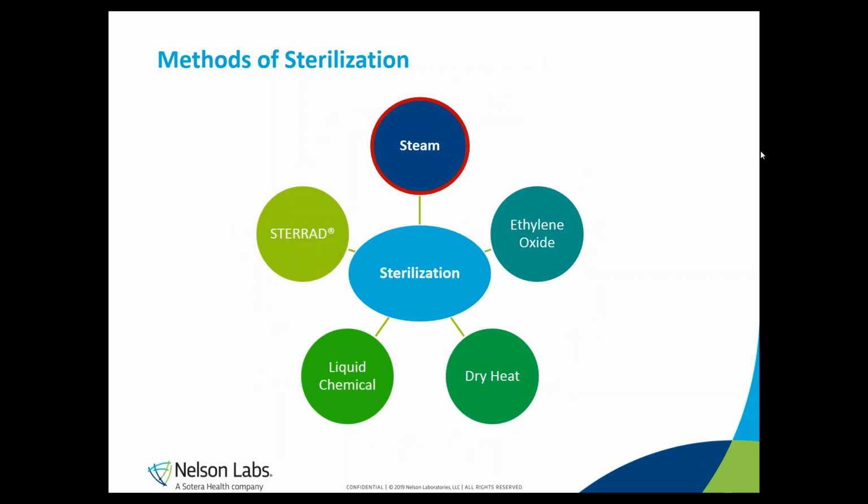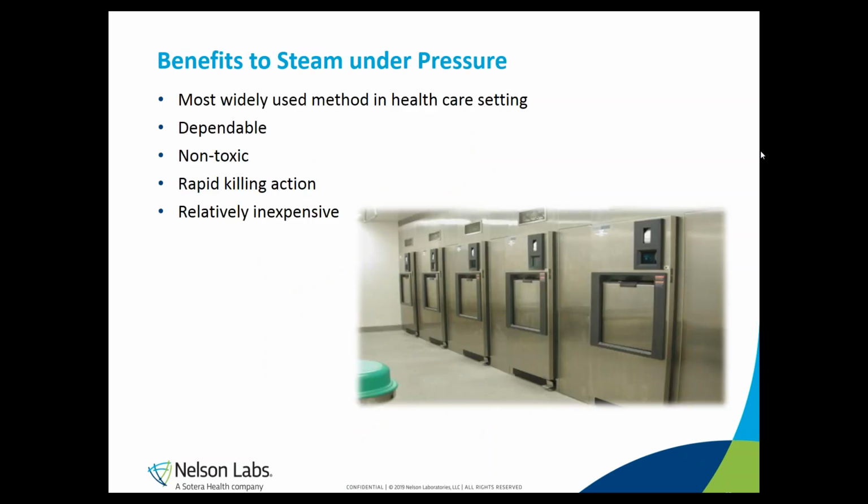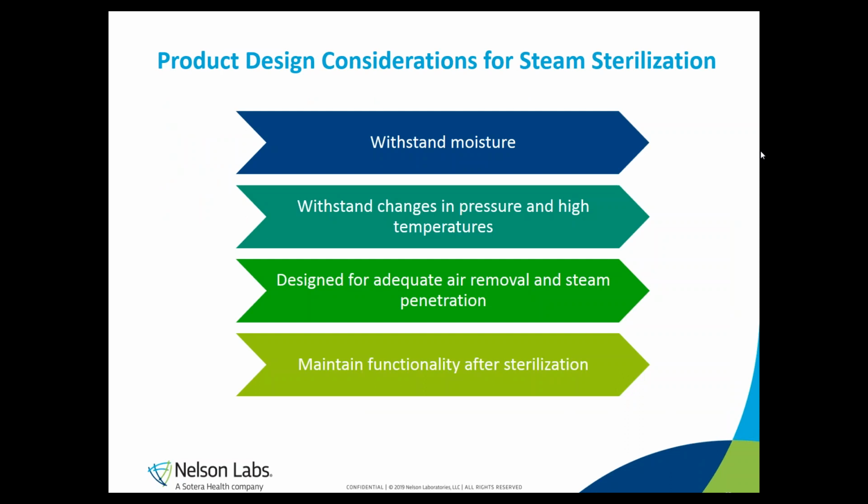There are many sterilization processes available, but the sterilization process predominantly used in healthcare facilities is steam sterilization. Here in this slide, you can see why steam sterilization is so popular in healthcare facilities. The process is non-toxic and dependable. In addition, steam sterilization is not only relatively cheap, the process is also characterized by a rapid killing action, and this is what we want.